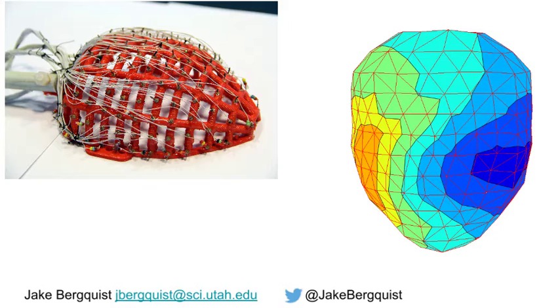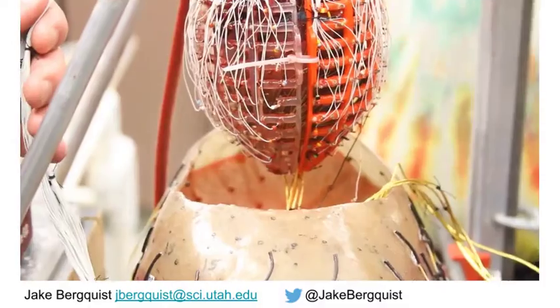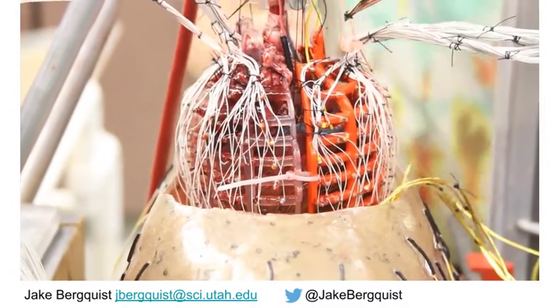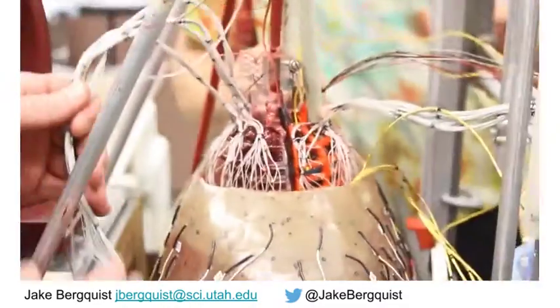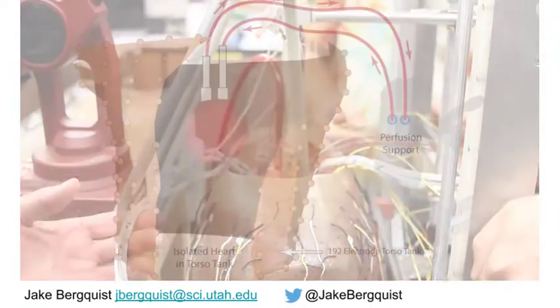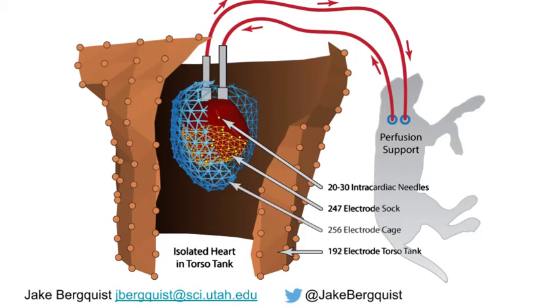The pericardiac cage is a 3D printed scaffold embedded with 256 recording electrodes. The electrodes are arranged in a closed surface around the heart, and the entire array can be lowered into the torso tank. This allows for excellent contact between the electrodes of the cage and the conductive medium within the tank, allowing for good capture of the cardiac signals. We can simultaneously record from all of these electrode arrays, achieving an unparalleled sampling of the cardiac source from multiple different locations.